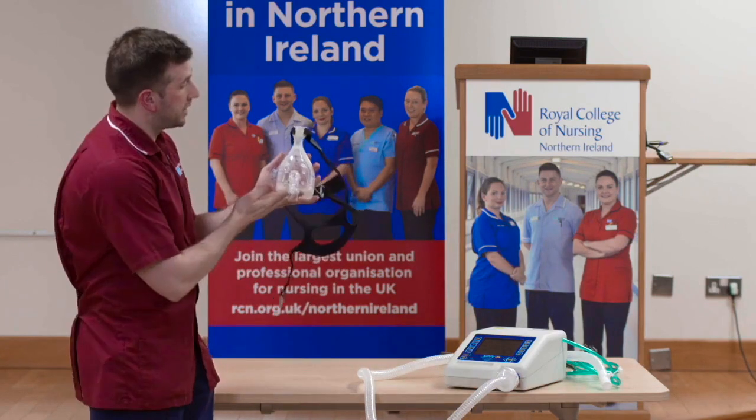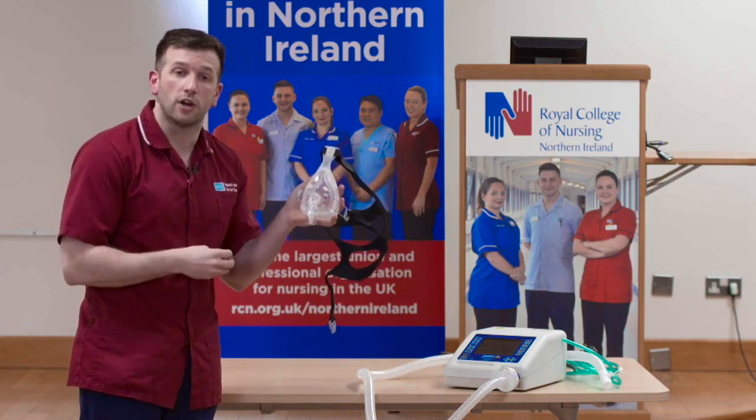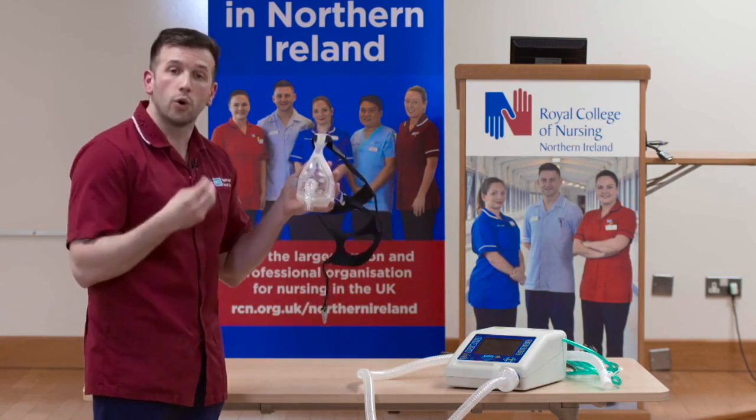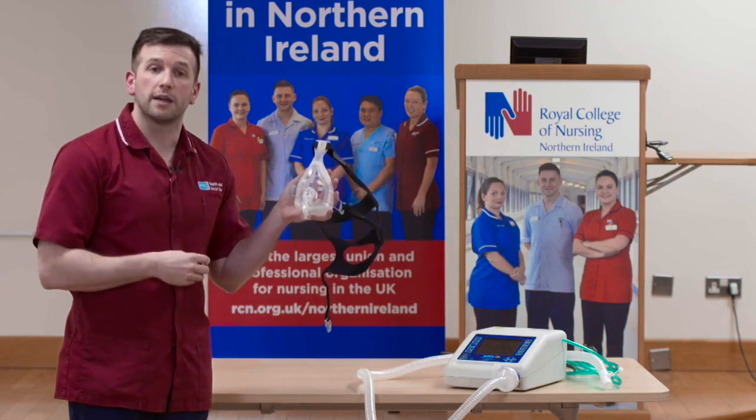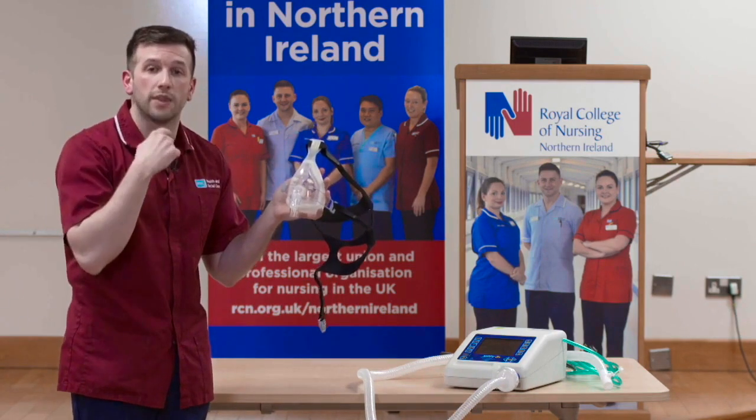The interface we're going to demonstrate to you today is the most common interface that you're likely to come into contact with, and it's called an oronasal or full face mask. So it's a mask that's designed to cover the structures of the nose and the mouth.